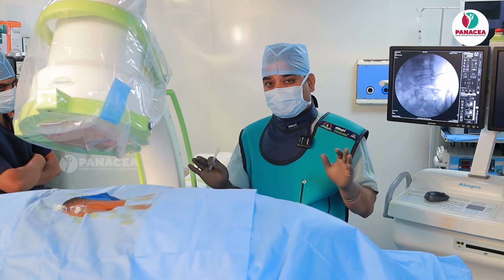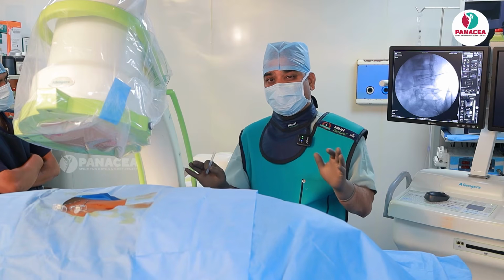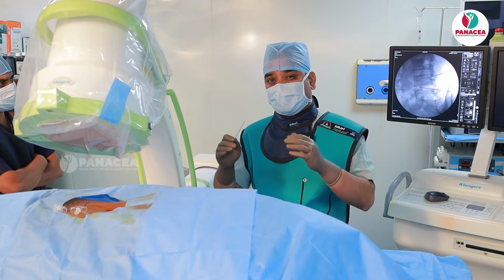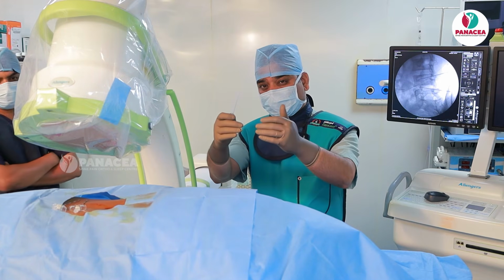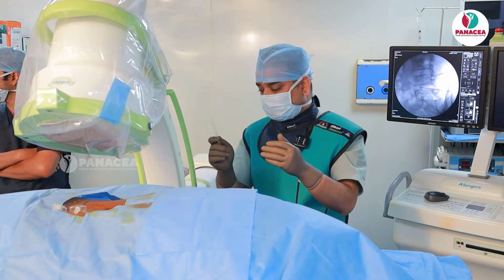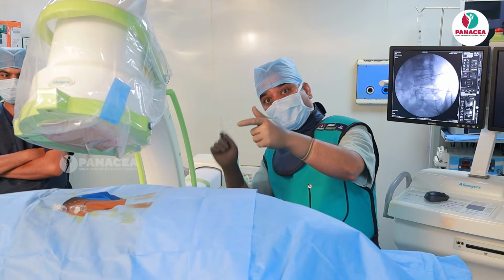There is no hard and fast rule; arbitrarily it is made 30, but you can wigwag the C-arm to 35 and 25. As I said already, the spinous process should be pushed to the opposite SAP-IAP junction. So now you see the C-arm is placed almost 30 degrees. Sometimes you may require 35 degrees also.